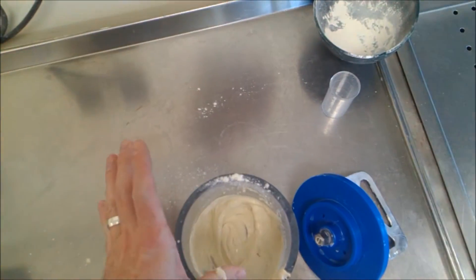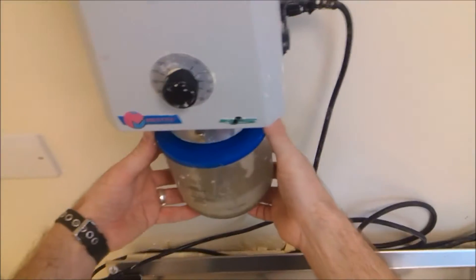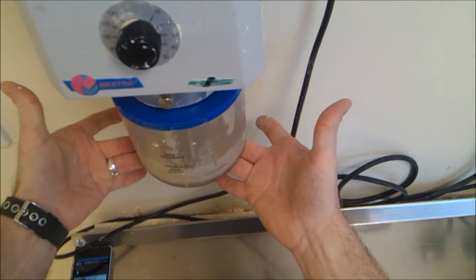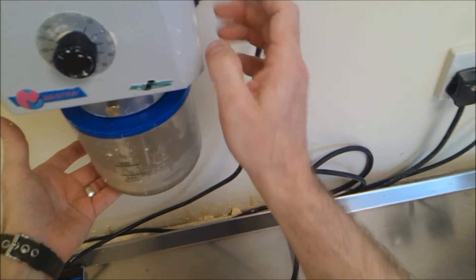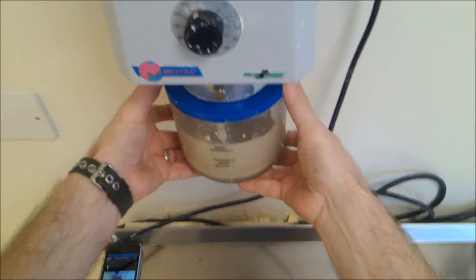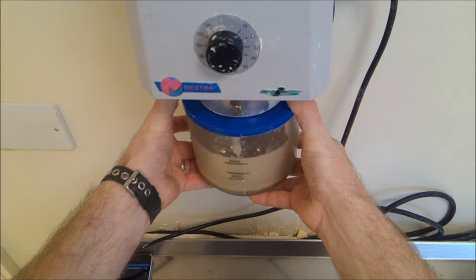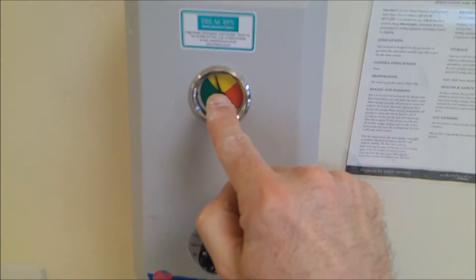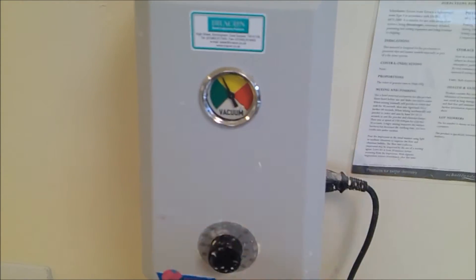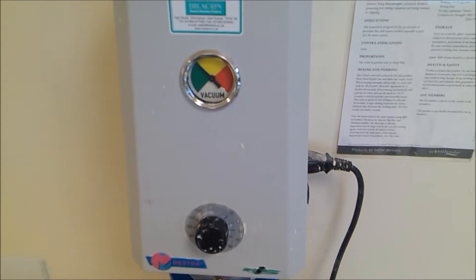Then a further one minute under vacuum. We're going to put the pot into the vacuum machine — okay, that's fully engaged now. Ensure it's on, turn the timer to 60 seconds, and hold the pot until the gauge achieves full vacuum. There you can see the needle just going round to the green zone. At this stage you can release the pot.